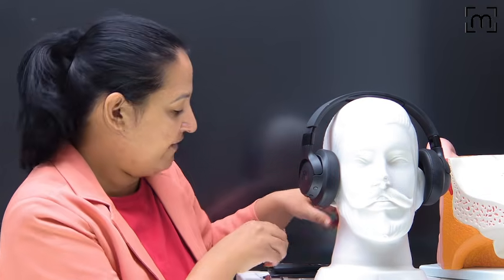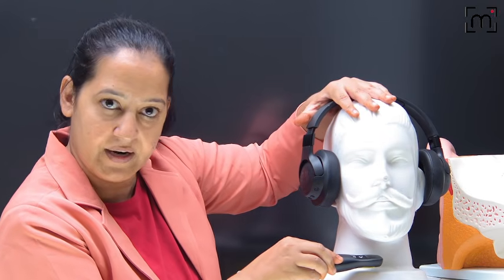After that, there was the third audiometry, Békésy, which is self-control. Here also in Békésy, we put the earphone and we give a button, a remote, in the hands of the patient. The patient himself or herself will increase or decrease intensity and set the intensity at which 50% of the sound is heard. So we are delivering the sound and the patient is increasing or decreasing the intensity. So that is self-control audiometry.